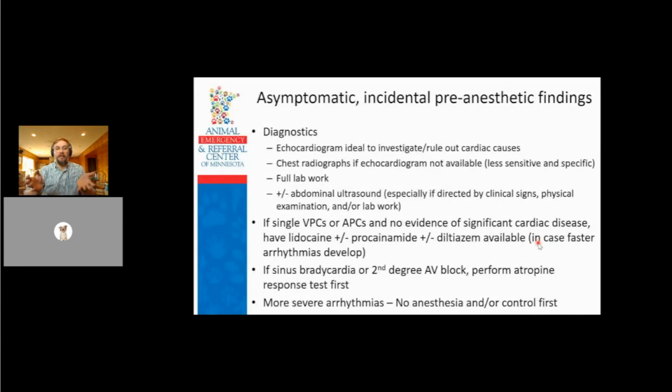This is kind of a review. What do you do? You're doing a pre-anesthetic exam on an asymptomatic animal. We see some single VPCs. Well, ideally we would do a full workup. We do an echo, do full lab work, you could even do an abdominal ultrasound.